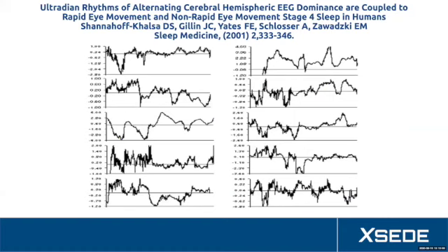So this is the data. This is 10 plots of 10 young, normal, healthy males that had relatively very little muscle artifact that would otherwise interfere with the EEG signal in our recordings. And you can see there's a period-like phenomena going on here, where it's going above and below the midline and so forth. The third one down on the left, of course, looks more sinusoidal, and that's what you expect in rhythms when you think about them. But in reality, these kinds of ultradians look more like this. So that's just 10 young, normal, healthy males.